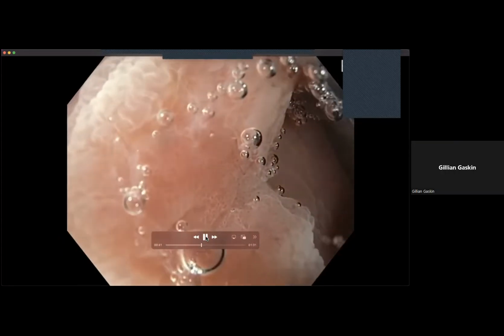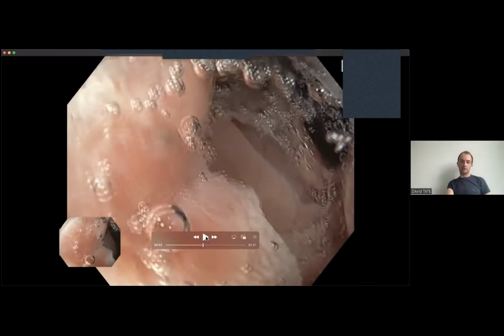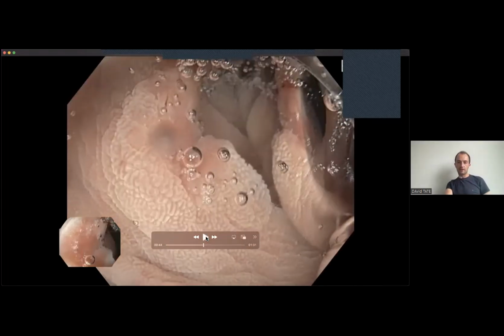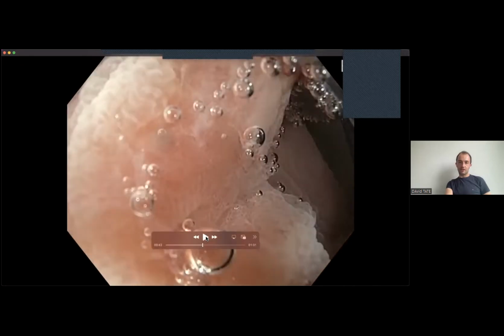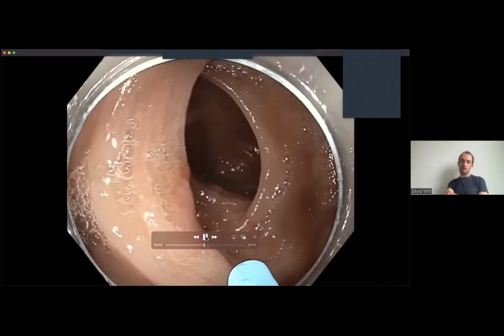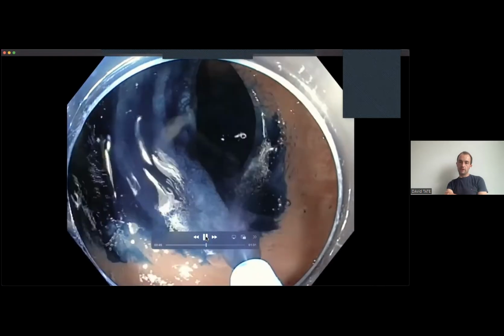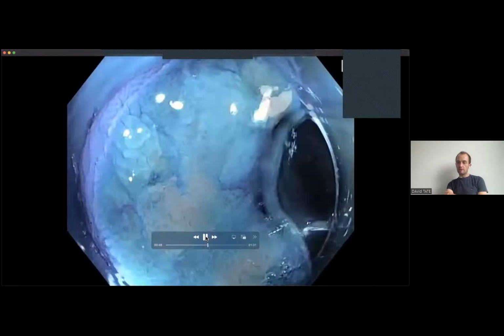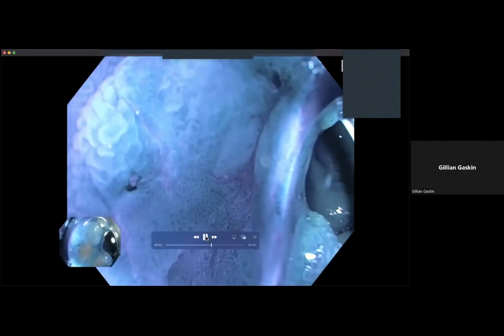There looks to be a slight demarcated area in the middle. Yeah, I completely agree with you. I wouldn't even say slight. I would take the slight off it and just say that there is definitely a demarcated area within that polyp. If that's the case, remember from the algorithm, then we don't worry about all the other things. We just look at that demarcated area to see if it's regular or irregular, because if it's irregular, we stop there and we call it cancer, right? Yeah. So what do you think?